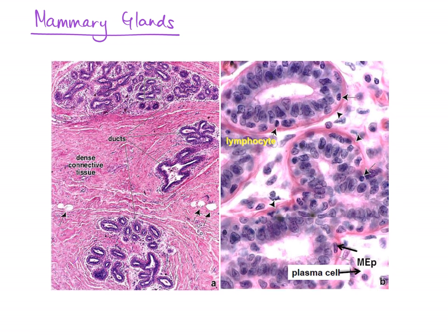Going through some other images of mammary tissue: on the left we have a low magnification image, and on the right we have a high magnification image of the lactiferous duct. The cells that line a lactiferous duct are either cuboidal or columnar in shape, as with most glands.